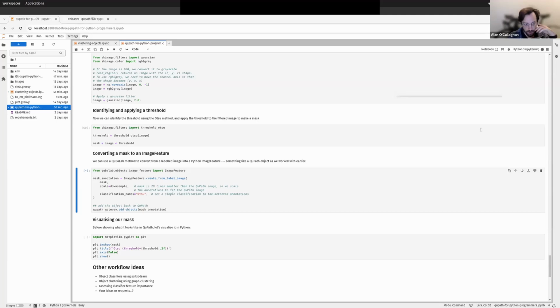For Mike's question, is it possible to look at the existence of other images in the project, switch the active image, image entry type objects, or anything like that? I actually do not know that. That's a hole in my awareness of the scripting API, I'm afraid. So I believe so, but I couldn't tell you the name of the method, certainly.